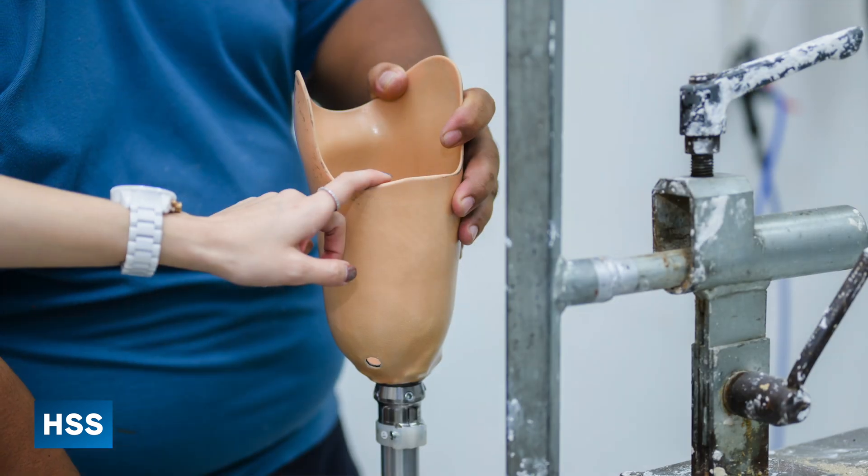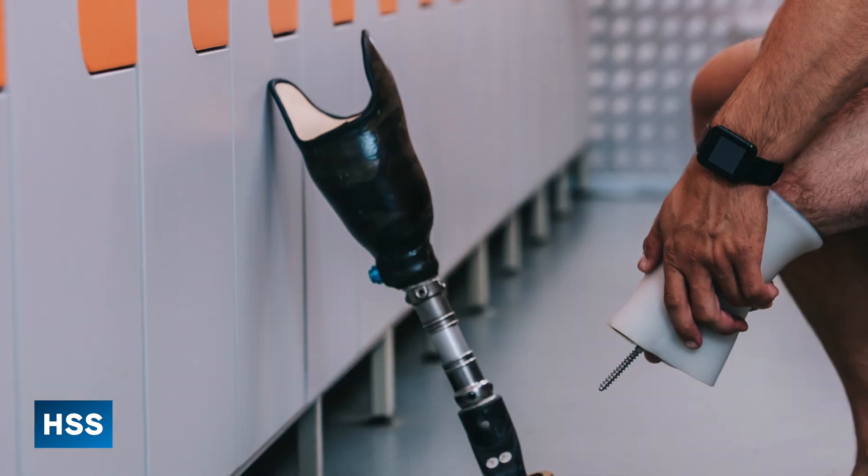Traditionally, when an amputation was necessary, it was performed and then the reconstruction afterward was really limited to using a prosthetic. Socket technology has been the mainstay of prosthetic care for a couple of hundred years — that's how you'd connect the prosthetic to the patient. I like to use the analogy of a denture for somebody missing their teeth. The connection between the patient and the prosthetic was limited at best. In the last few years, there have been a lot of advancements in prosthetic technology.